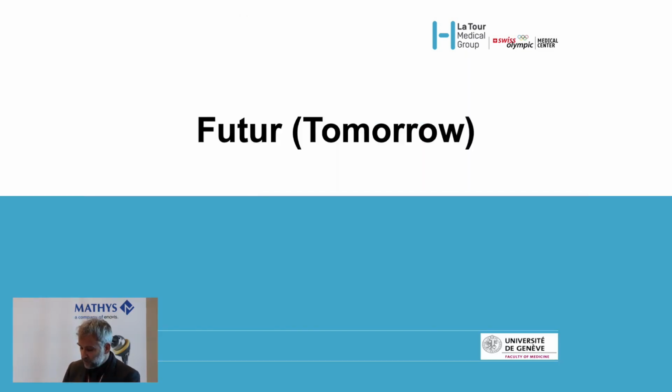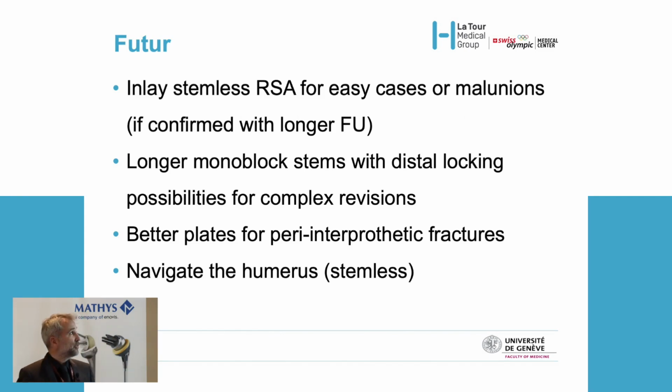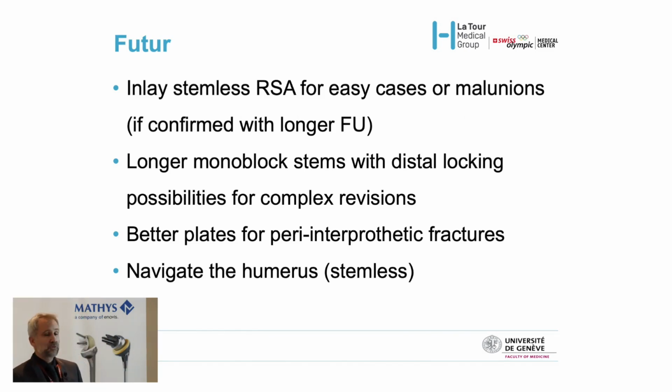And what about the future? This was the main topic of this presentation. I think that the future is stemless reverse shoulder arthroplasty for primary easy cases or malunion, but we need to wait and confirm with follow-up first. We need better stems, so longer monoblock stems with a distal locking possibility for complex revision. We need better plates for periprosthetic fractures, and we also need to navigate the humerus. This is the key if we want to implant stemless prostheses.